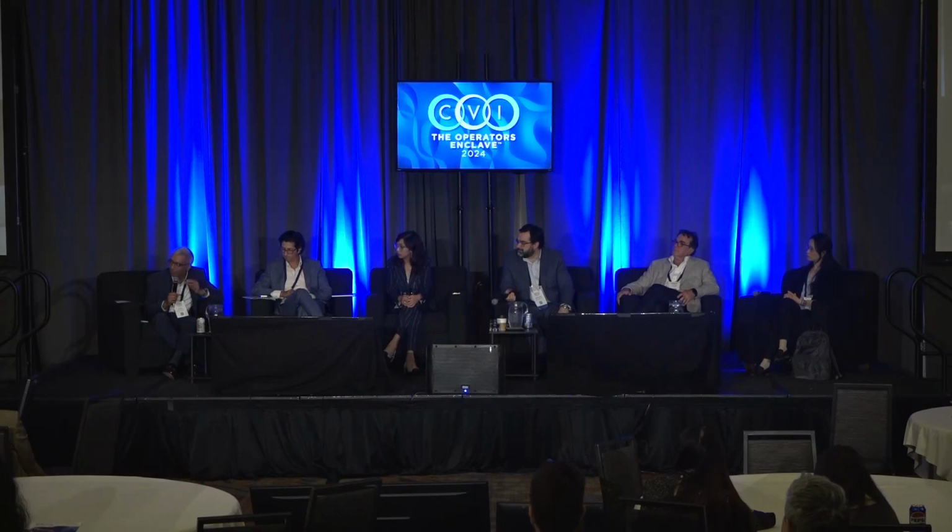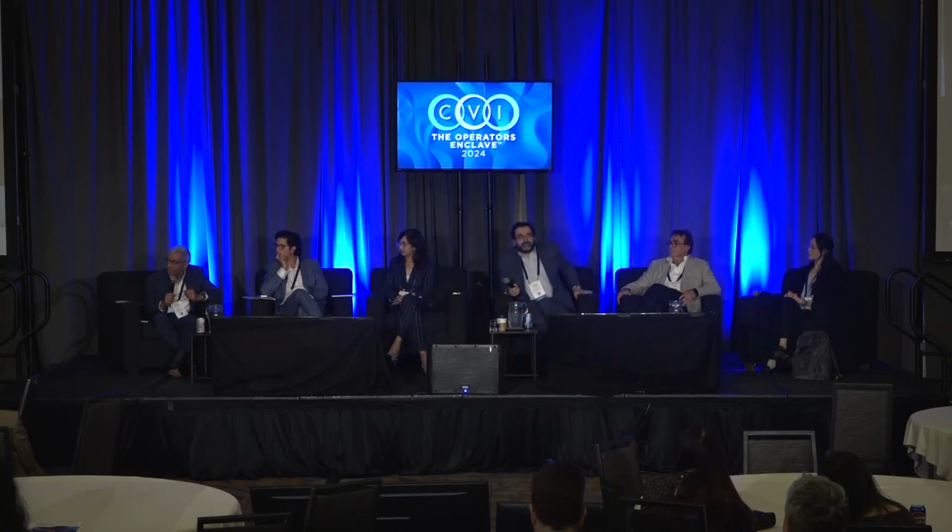But yes, it's non-inferiority. And the other question is, we had the Lariat, which was not necessarily similar in the sense that it was partly coming in from the outside, but there were leaks with the Lariat, and those leaks were in fact more likely to produce DRT because they were pinhole and very high velocity jets forming in those segments. And I think when people see this, they think, oh, that's like Lariat, but it's actually nothing like Lariat.